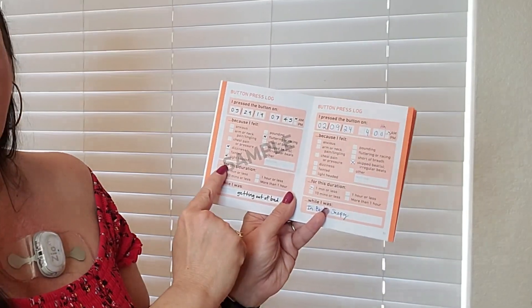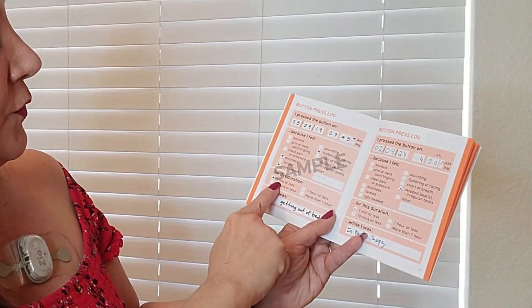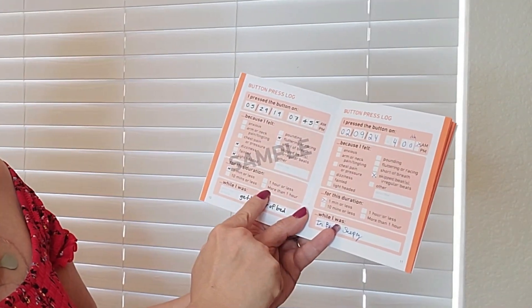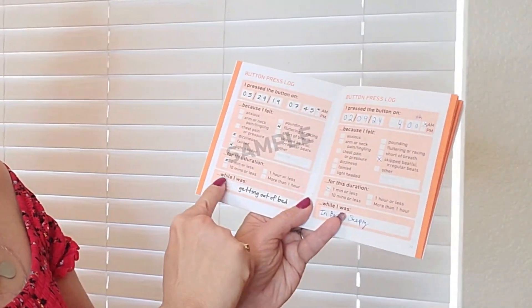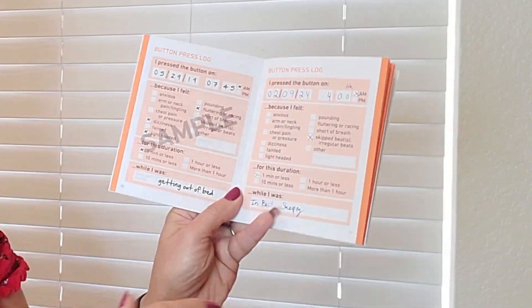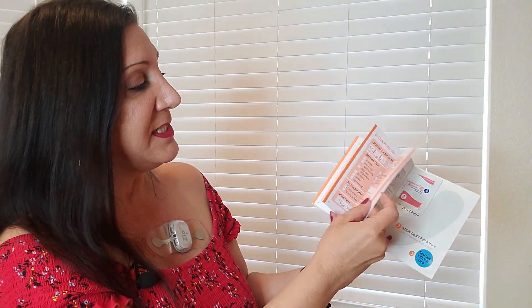Then write the duration: one minute or less, 10 minutes or less, one hour or less, or more than one hour. And write down your activity at the time. They provide several pages for this. If you run out of space like I did, you can make a copy, or just write it on a sheet of paper and include it along with the booklet.